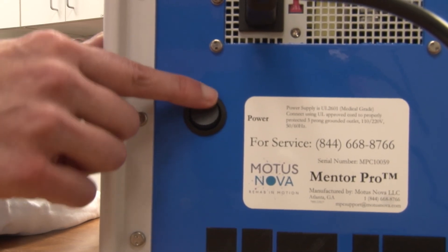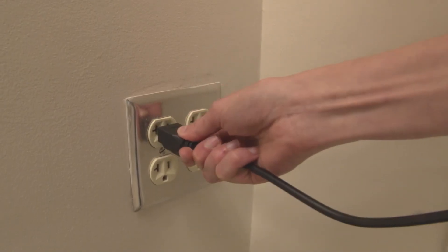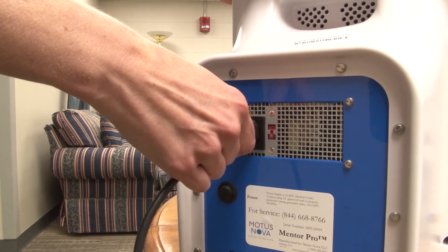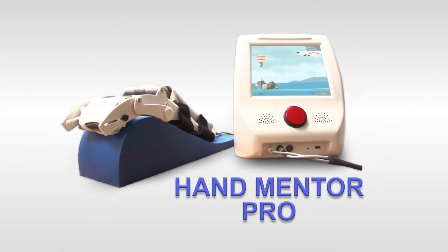Now go to the back of the control box and switch the power off with the power switch. Unplug the power cord from the wall outlet and from the Hand Mentor control box, and store your Hand Mentor in an easily accessible place for future use.